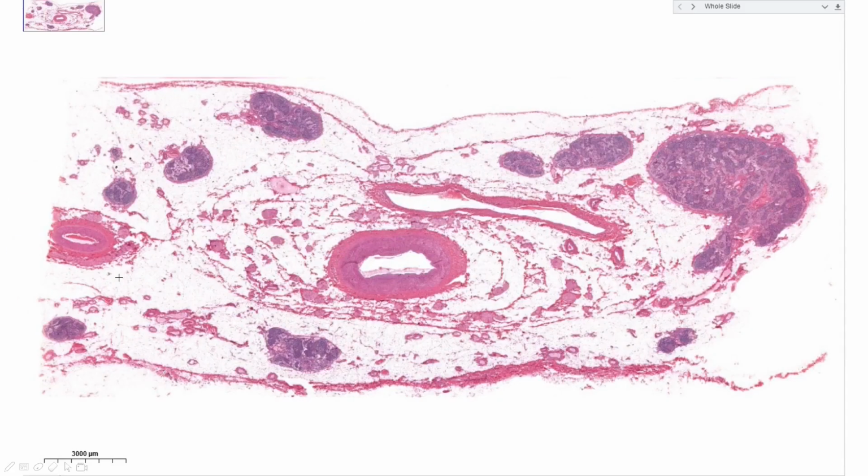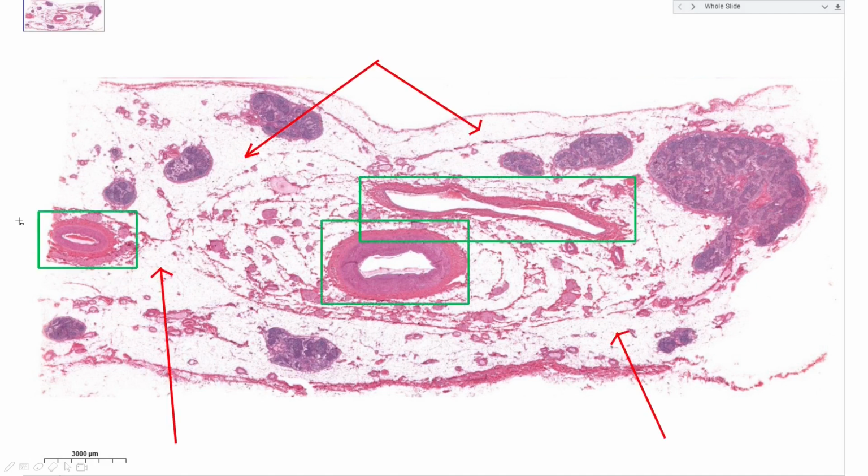We are going to look at a tissue specimen taken from the mesenteries. We talked briefly about the mesenteries in the last lab. But to review, the mesentery is the part of the peritoneal cavity that holds the organs of the abdomen. Many organs are suspended within the peritoneal cavity by mesenteries, which is primarily composed of areolar connective tissue. However, also scattered within the mesentery are adipose tissue, blood vessels, nerves, and lymph nodes.